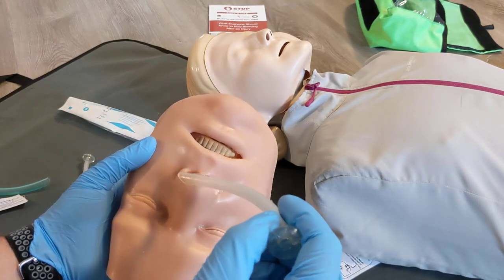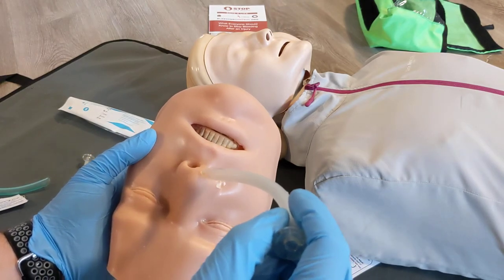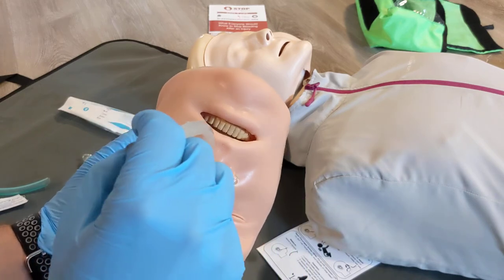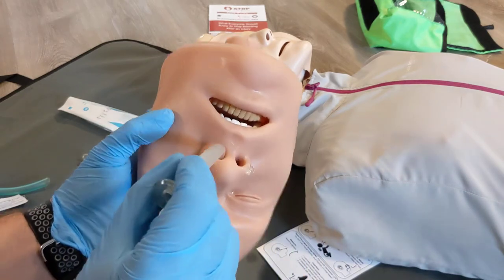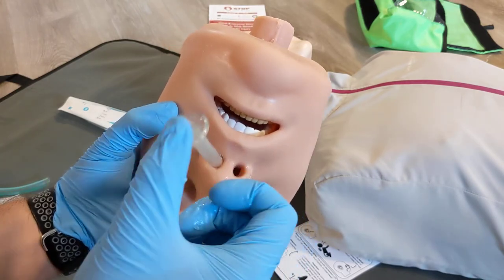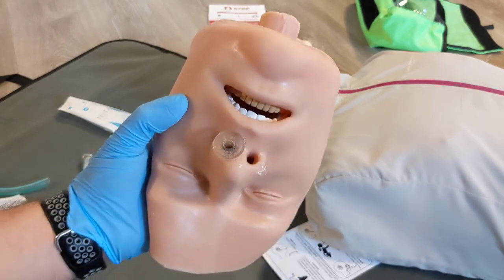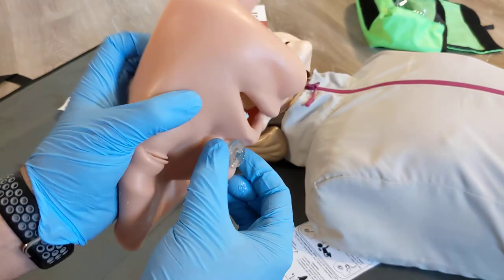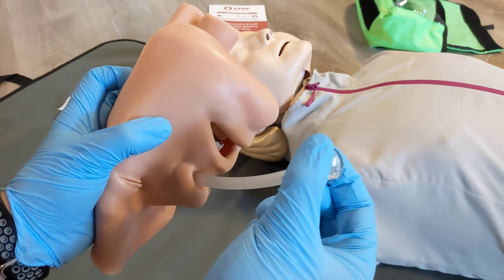If we had to use the left nostril because we were getting resistance on the right, again you start with the point away — upside down. You're just going to feed it in and you'll see that the airway will naturally turn itself as you go down, so you don't need a lot of force. You're just gently placing it, and if you have to remove it, you can just pull it straight out.